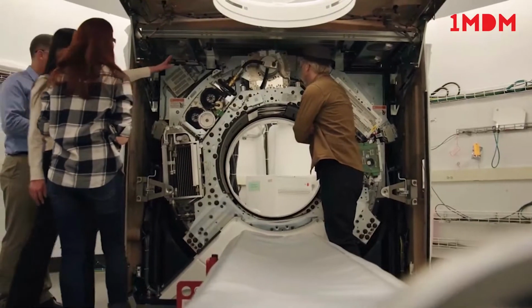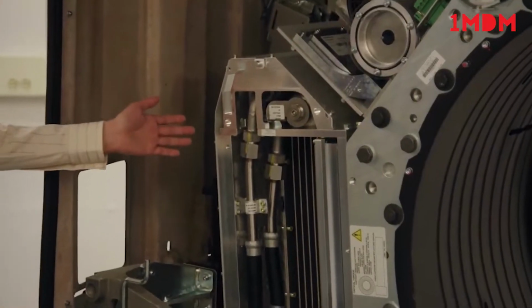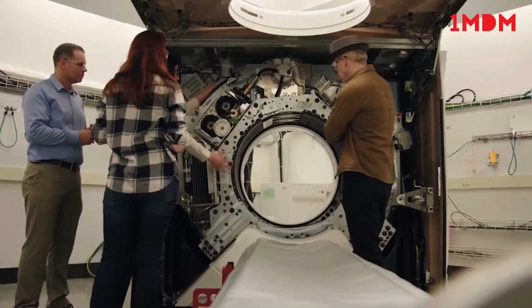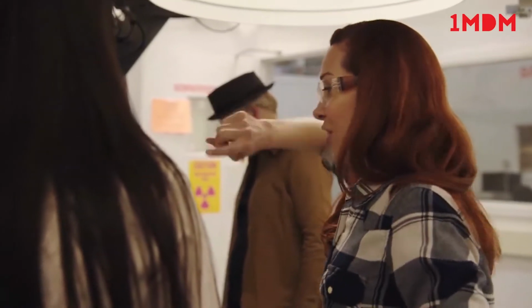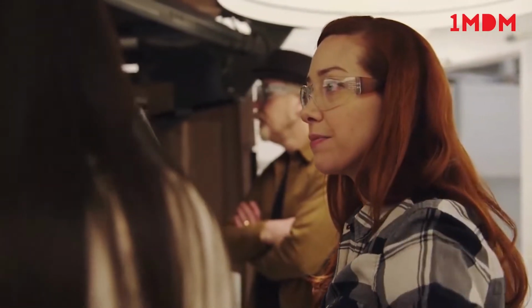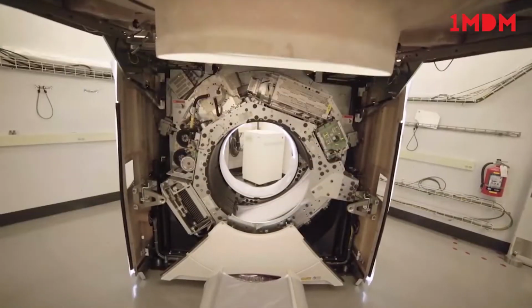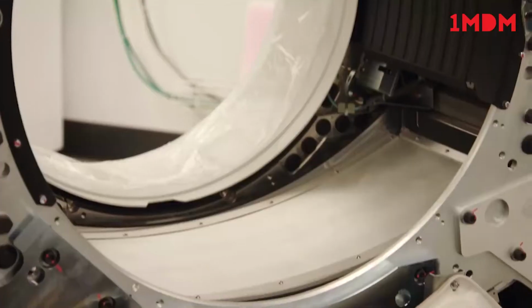So up here is the X-ray, and right across from it is the detector. This is the heat exchanger. This is the generator, and all of this is rotating around the patient. Oh wow. Is that why it's called a revolution? Is because it's revolutionary and it makes a... Oh, I just got that right now! Now, it shoots an X-ray through your body and onto the detector plate? Correct. So what's interesting about your detector plate? What's new? So in contrast to other machines, this detector is 16 centimeters across.